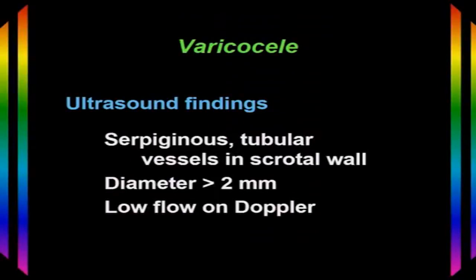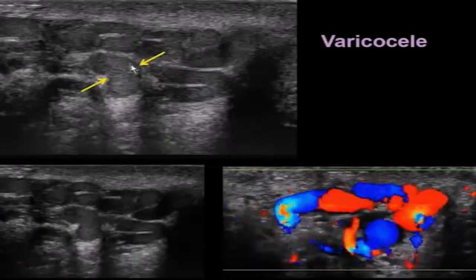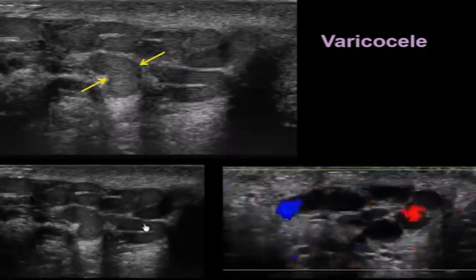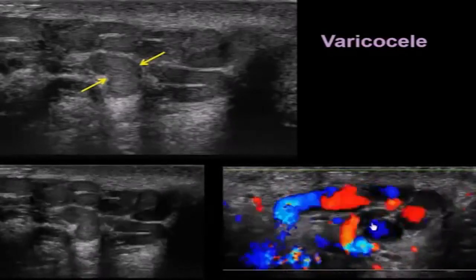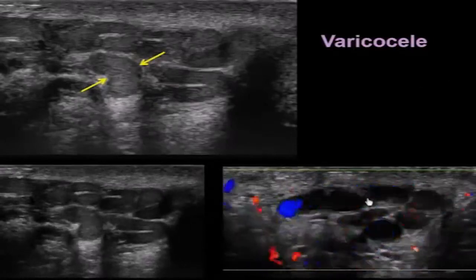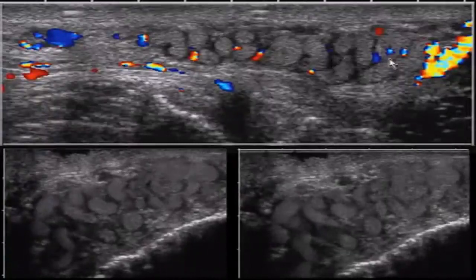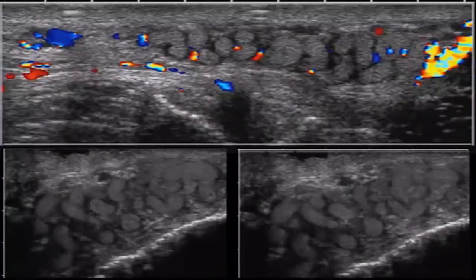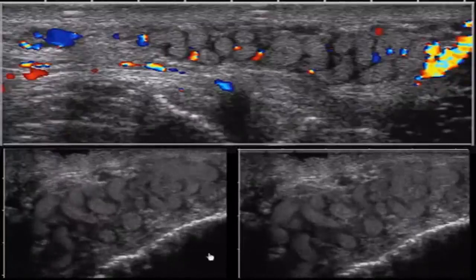The diameter of varicocele vessels is 2 millimeters or more, and we may see slow flow with grayscale or color Doppler. Here's a patient with a varicocele — you can see tubular vessels in the scrotal wall with very slow flow visible on 2D imaging, and flow elicited by a Valsalva maneuver on color Doppler. In another case, there are lots of serpiginous vessels, but the flow is so slow that color Doppler cannot detect it — we can only see these vessels on grayscale, with lots of venous flow inside them.